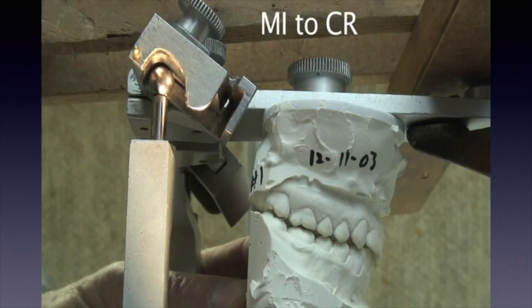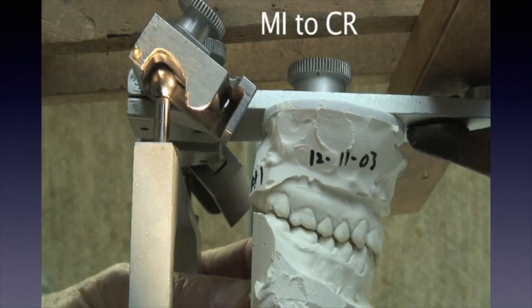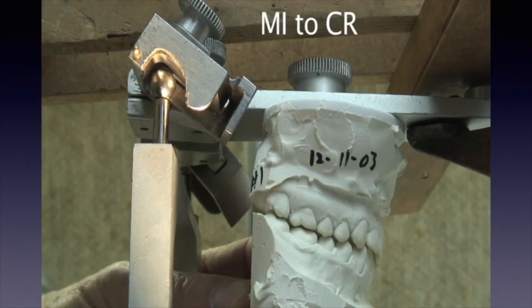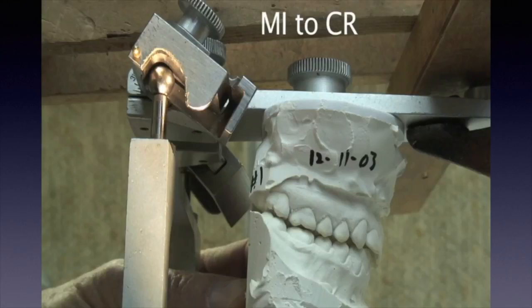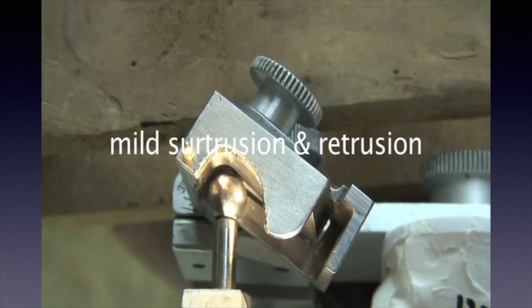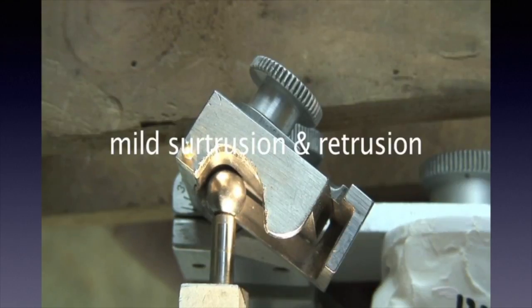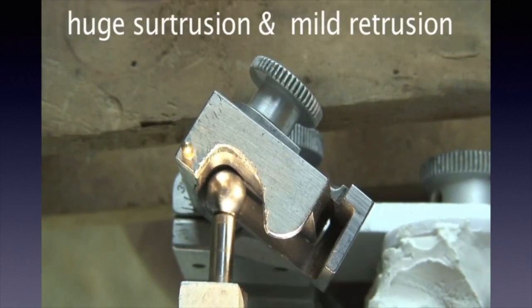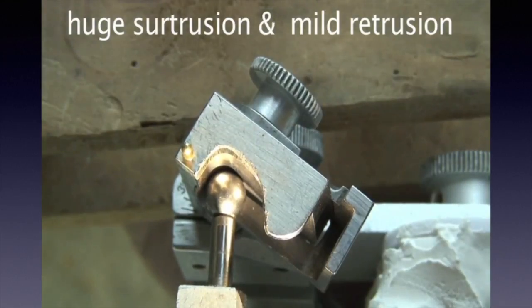This is a mild condylar posture change from MI to CR. Another with a mild amount of change. This one requires a huge amount of surtrusion and a little bit of retrusion.